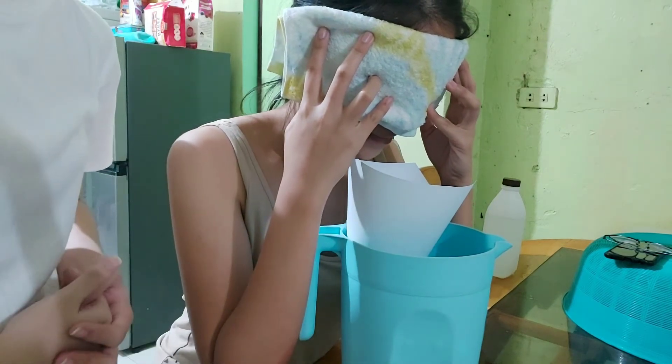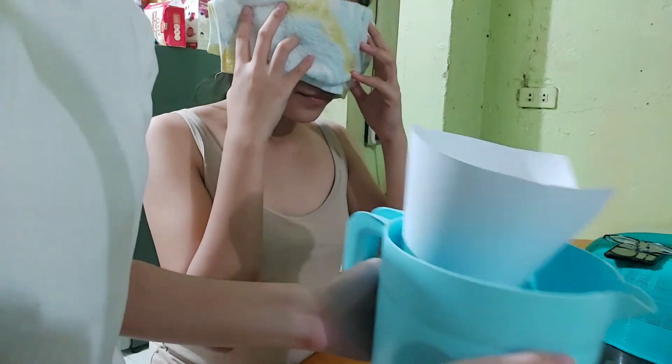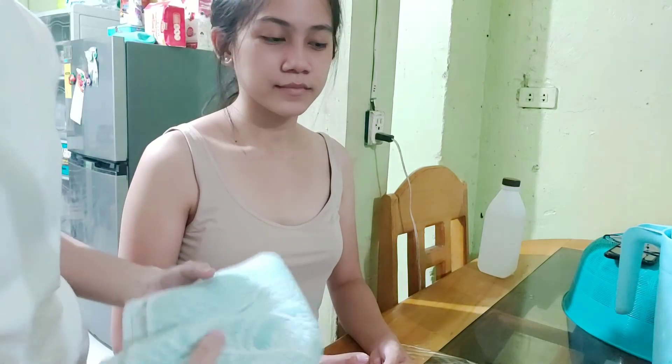After 15 minutes, I will then remove the pitcher after the prescribed duration. I will then wipe the patient dry and place her in a comfortable position.